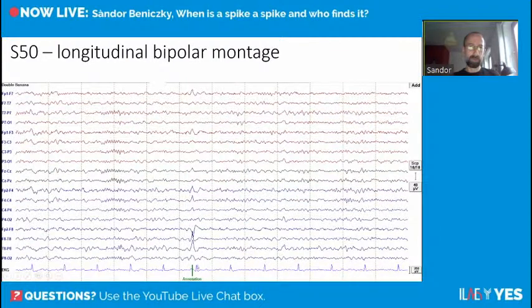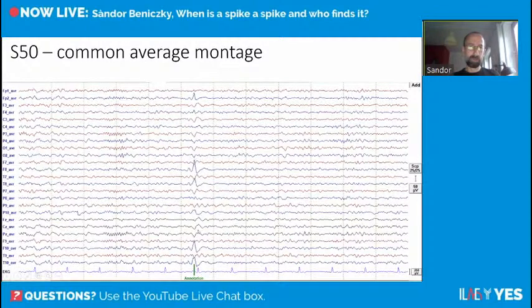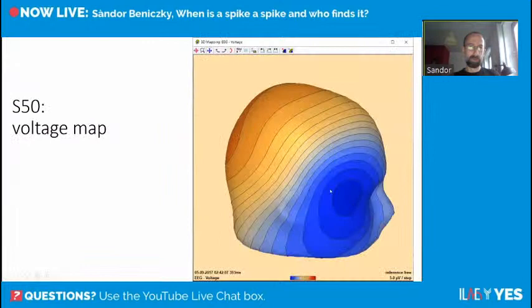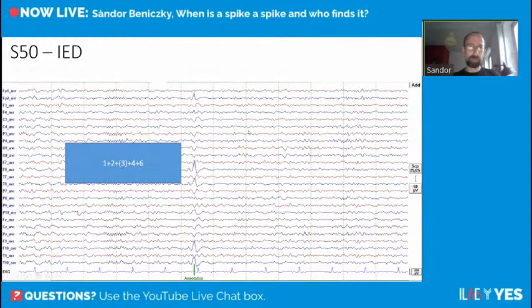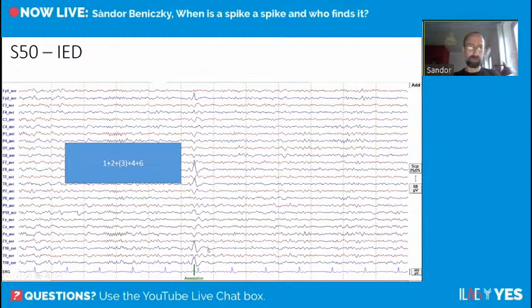Next example: a sharp thing with a phase reversal in bipolar montage, and in common average montage a very nice voltage map corresponding to a brain source. Criteria fulfilled: it's spiky (1), wavelength is absolutely different (2), asymmetry is present though not fully clear (3 in parentheses), a nice slow wave grows out of the tail (4), and a very nice voltage map (6). This fulfills the criteria.